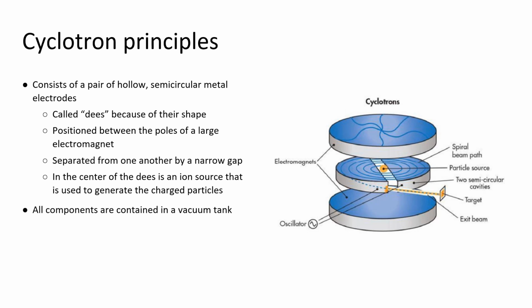So this is a side schematic of the cyclotron. You have two electromagnets here on the opposite ends of each other, and then inside is where it accelerates to a high rate of speed.